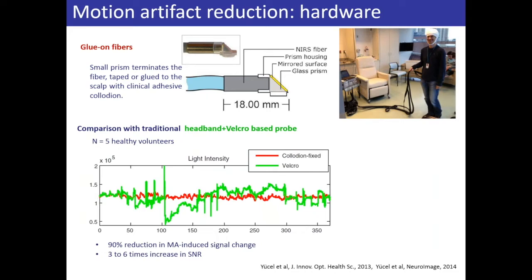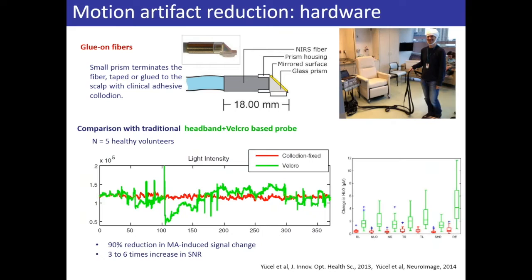And we asked subjects to do different motions, nodding up and down, or talking, or shaking their hands, etc. And overall, we observed a great reduction in motion artifact-induced signal changes, and also a 3 to 6 times increase in signal-to-noise ratio. And here on the right, we show the signal change due to each different type of motion artifact. Here, for instance, RL is moving the head to the right and left. This is like nodding up and down, etc., like talking. And on each of these different movements, we observed a different amount of change in the signal. Interestingly, raising eyebrows resulted in the highest signal change because, as I mentioned before, it moves the skull. But glue-on still worked well here. You can see the results from glue-on fibers.